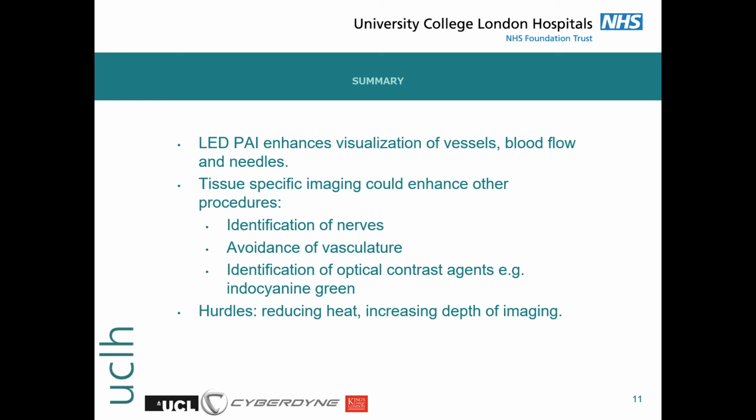We can envisage a future where photoacoustic imaging using LED sources could be integrated into clinical ultrasound systems to enhance the visualization of structures such as nerves, blood vessels, muscle and bone. Safe identification of these is paramount to safely performing a wide variety of medical procedures, not just vascular access, and photoacoustic imaging is very likely to have a role in tissue-specific imaging complementary to standard B-mode ultrasound.